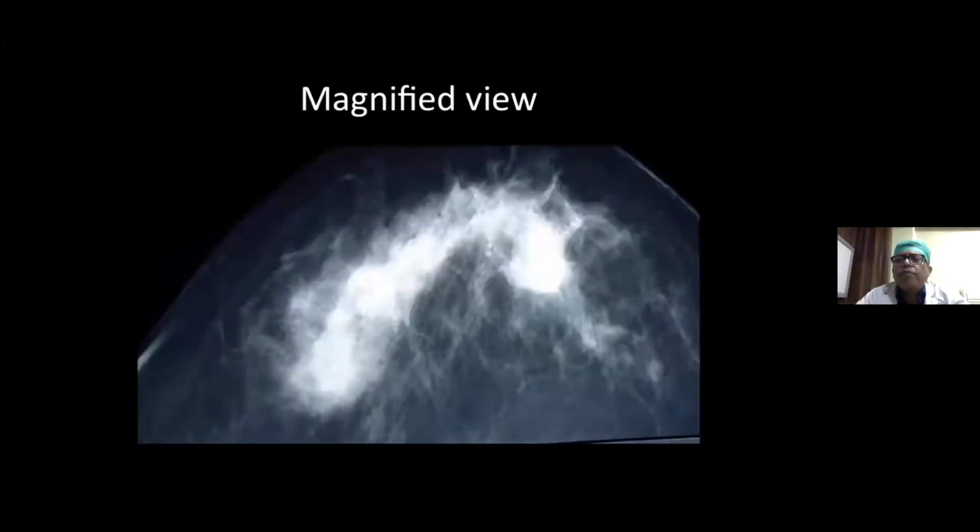What we did, we magnified it. And once you magnified it, you find that there are small dots, and these are classical examples of amorphous microcalcification. We did a guided core biopsy, and the report came out as a malignant lesion, with examples of gross extratumoral DCIS. We had to call back the patient because this patient also had a microcalcification in this area and go for a mastectomy. So you understand these are unexplained microcalcifications which do not fit to the ones that is classically described as classical microcalcification.